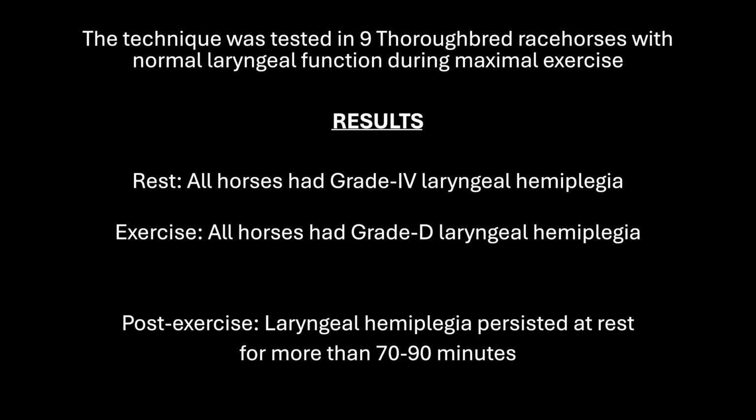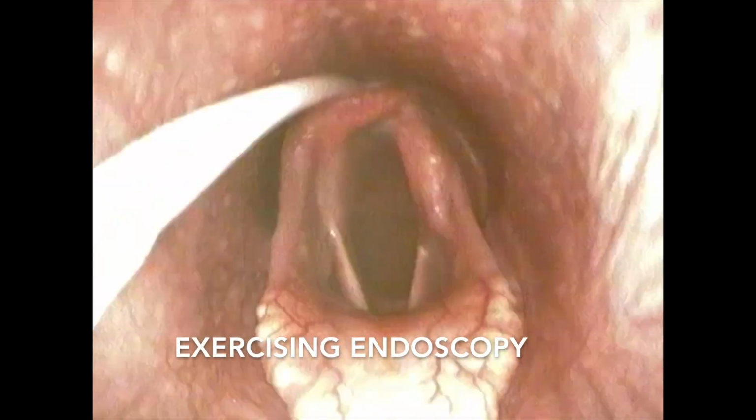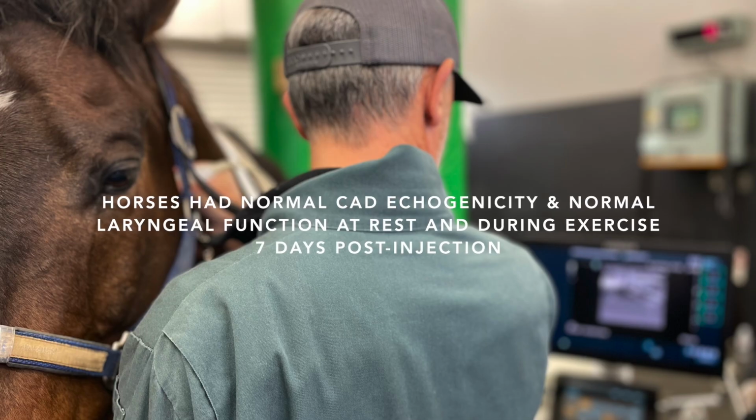This technique was tested in 9 thoroughbred racehorses with normal laryngeal function during maximal treadmill exercise. All horses had grade 4 laryngeal hemiplegia within 5 minutes of injection and performed maximal treadmill exercise with grade D laryngeal hemiplegia, which was confirmed using overground endoscopy. Laryngeal hemiplegia persisted for more than 70 to 90 minutes, however, it was not rechecked beyond 90 minutes. All horses were examined a week later and were confirmed to have normal echogenicity in the CAD muscle and normal laryngeal function at rest and exercise.